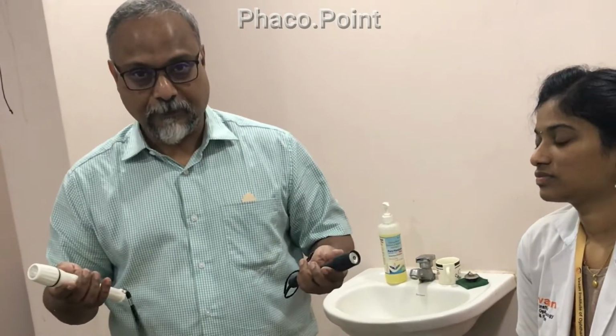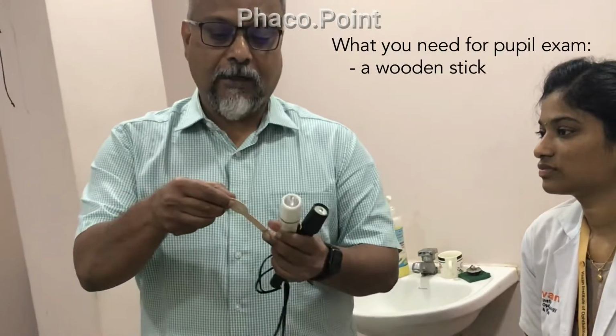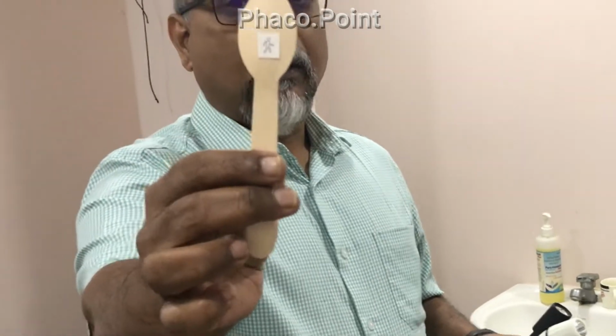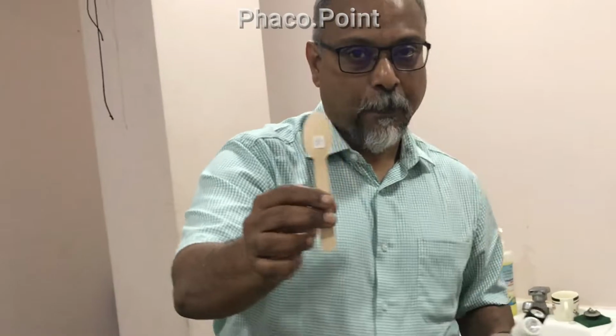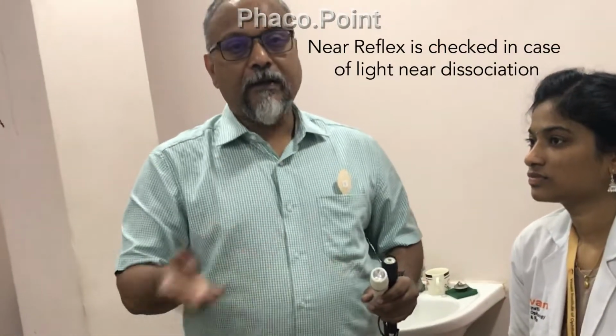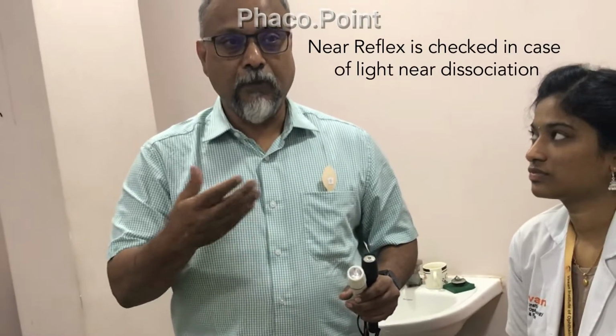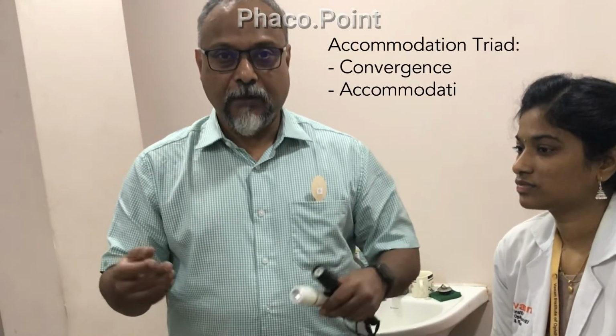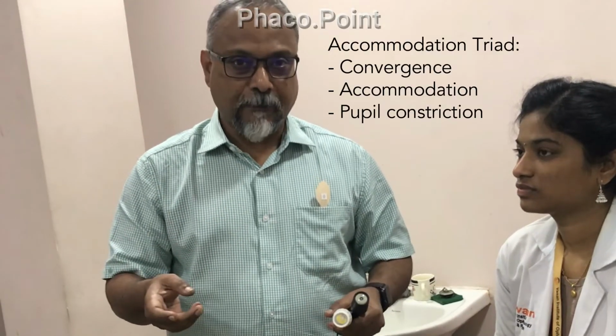The second important thing is to have a stick like this, which has an accommodative target on which the patient can fix. This is important, especially when we are checking the light-near dissociation and when we are checking the pupillary reaction to a near object. Like you have the accommodation triad, which is convergence, accommodation and miosis.